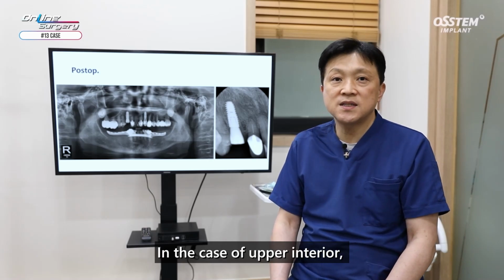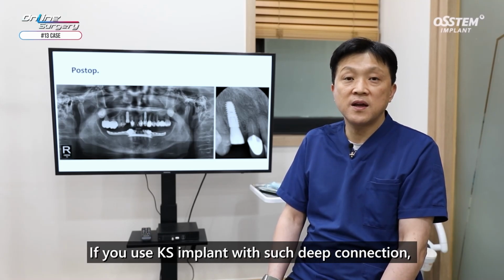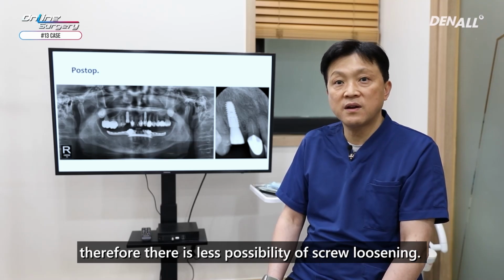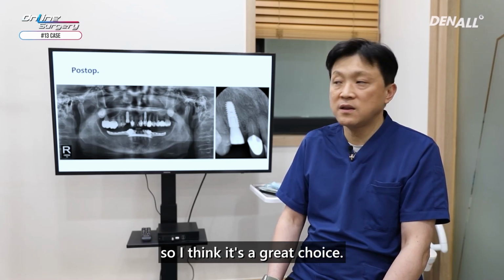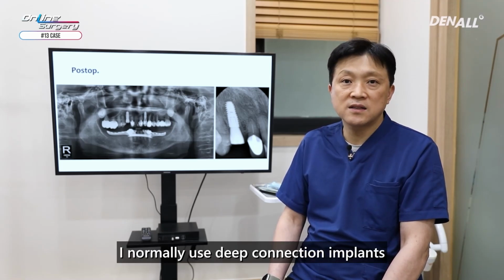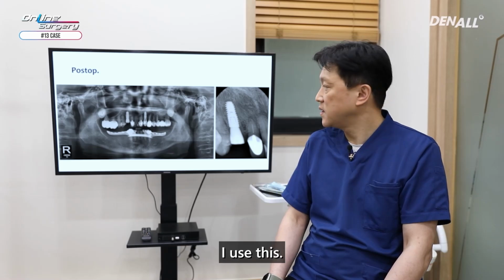In the case of upper anterior, your choice of implant diameters is quite limited. If you use a KS implant with such deep connection, then stability between the implant and abutment increases, therefore there is less possibility of screw loosening. Even with smaller diameter, it can withstand stronger occlusal forces or guidances, so I think it's a great choice. In my case, I normally use deep connection implants in lower anterior or upper anterior. In areas where you cannot really use wider diameter implants, I use this.